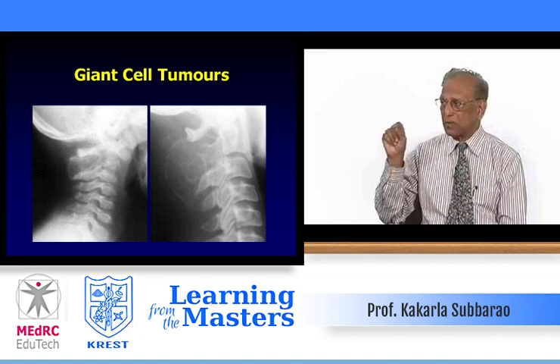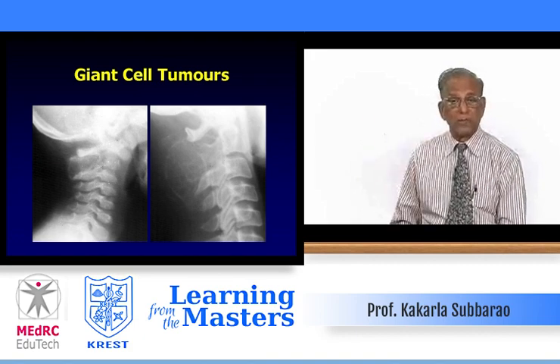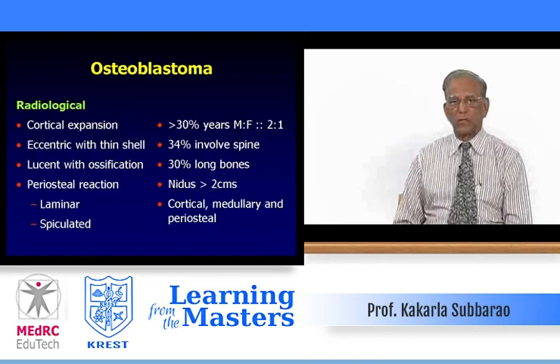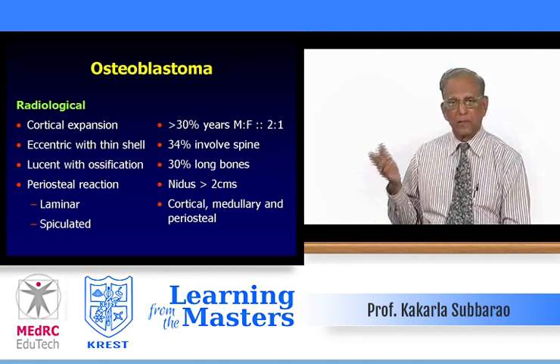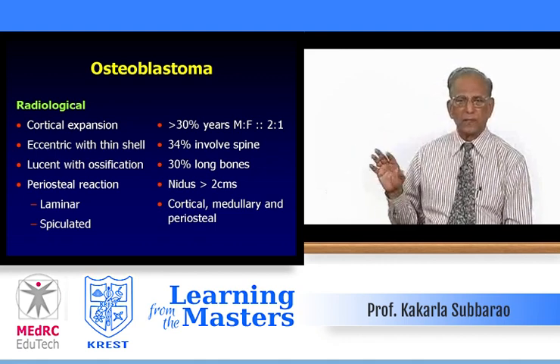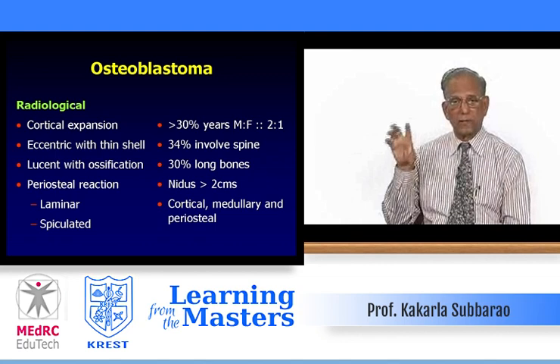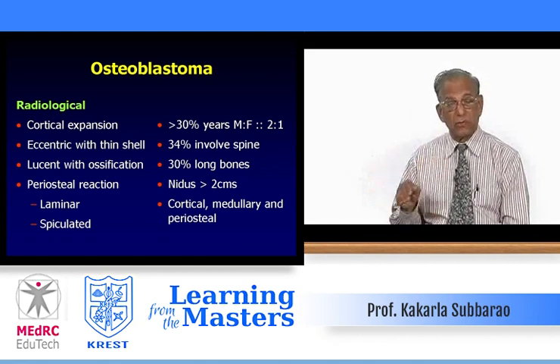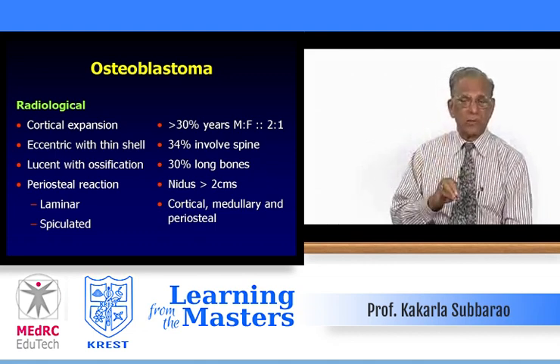Cervical spines — two patients, lateral views. On the left side, the lesion looks benign and is expansile with a sclerotic margin. The matrix has a ground-glass appearance, as seen in fibrous dysplasia — meaning osteoid is present but not properly mineralized to form bone. Regarding osteoblastoma: clinically, males predominate; the condition typically occurs around age 30. About 34 percent involve the spine, particularly the posterior elements, occasionally the body. The major difference between osteoblastoma and osteoid osteoma is that in osteoid osteoma the nidus is less than 1.5 cm, whereas in osteoblastoma it is more than 2 cm.